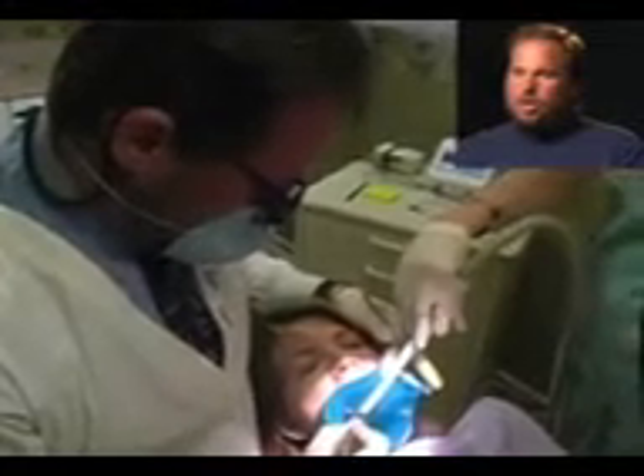When we do a root canal, we're basically removing the nerves and blood vessels inside the tooth. The first part is very much like a routine filling, which is what we're doing here — opening the tooth. Technically this is called an access.